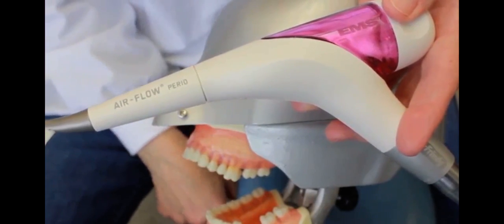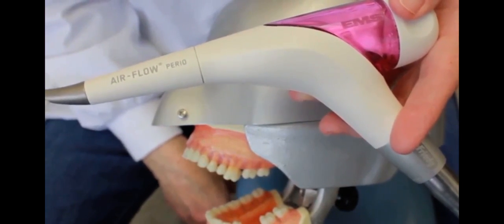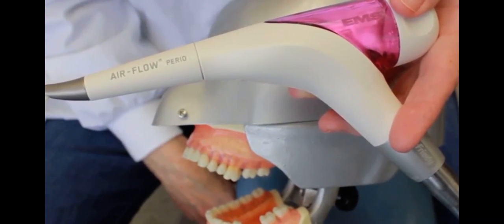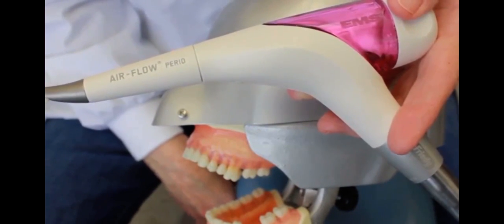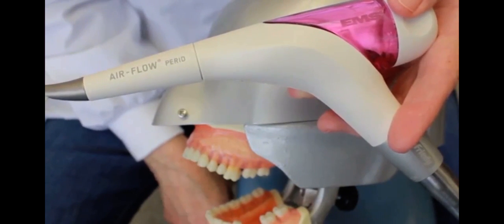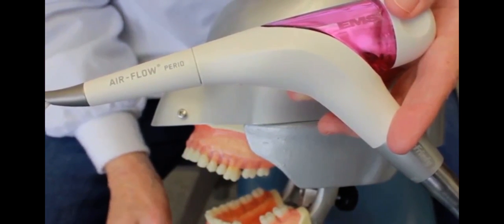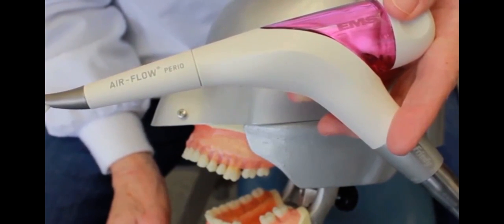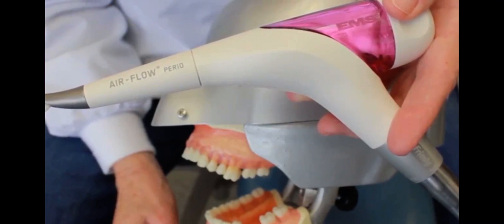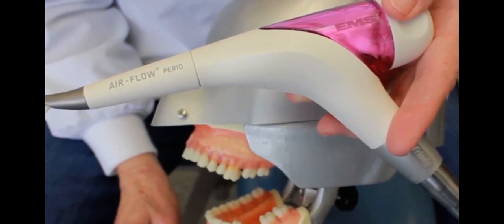We are restricted by the Food and Drug Administration to 5 millimeters pocket depth — that's the maximum that we can use our subgingival air polishing. The person you choose to use this procedure on has to have at least three millimeters of bone. Anything less than three millimeters of bone support, the person is not a good candidate for air polishing.